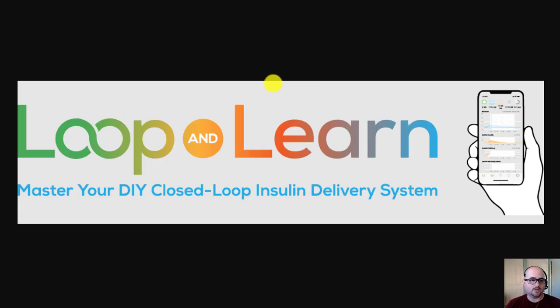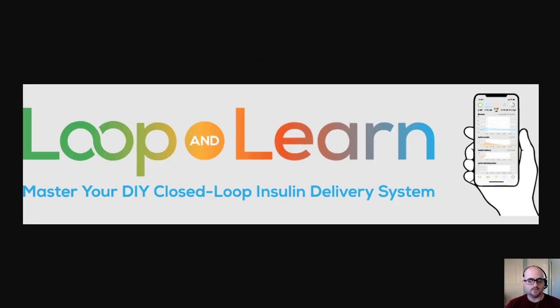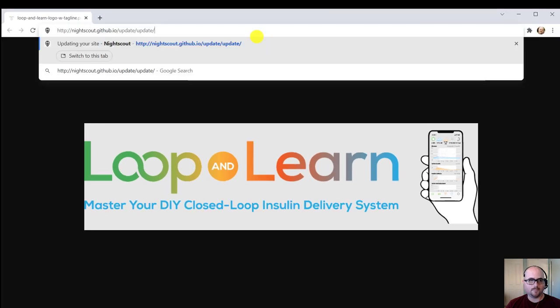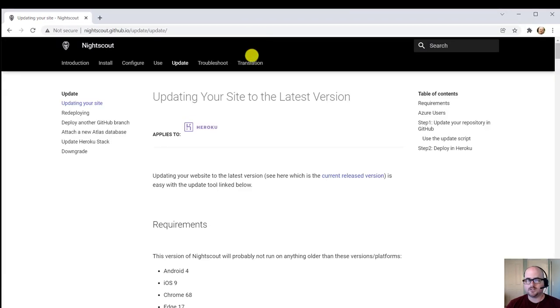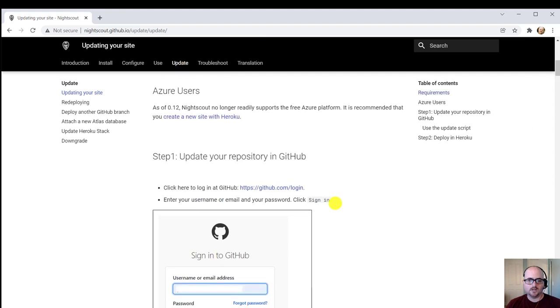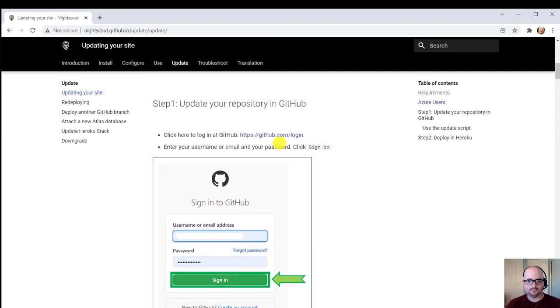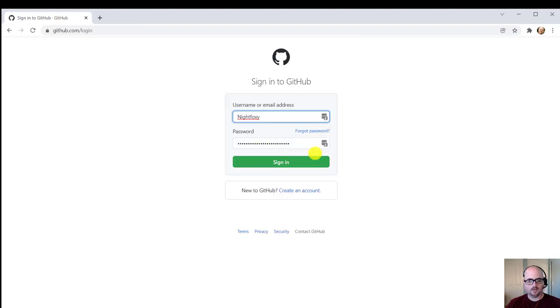So what we're going to do is start with the NightScout update page for the instructions. On the update page, scroll down to step one, and we're going to log into GitHub. Just click on this link, and you'll be taken to the GitHub login page.